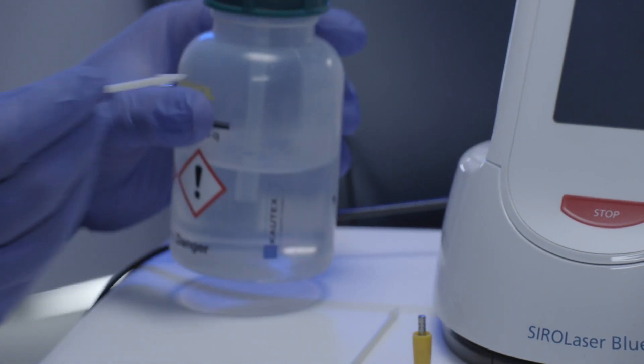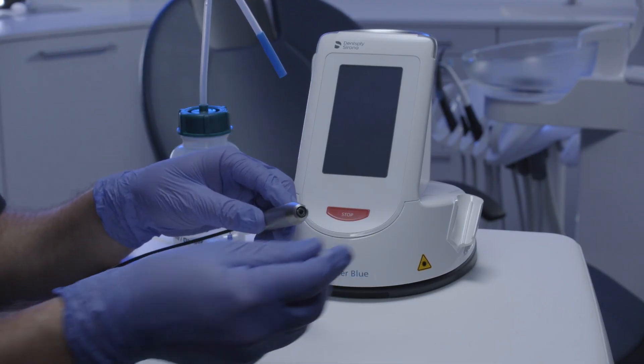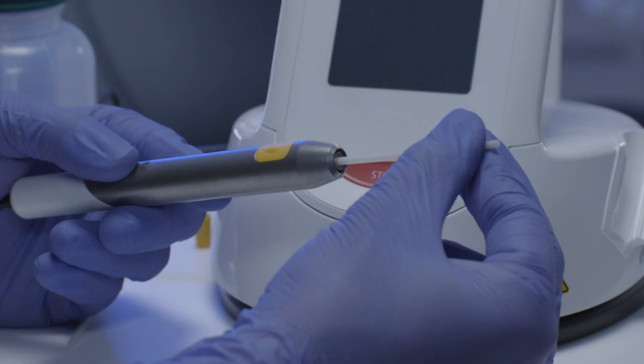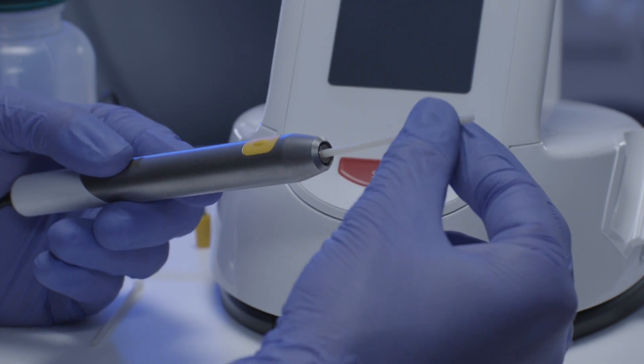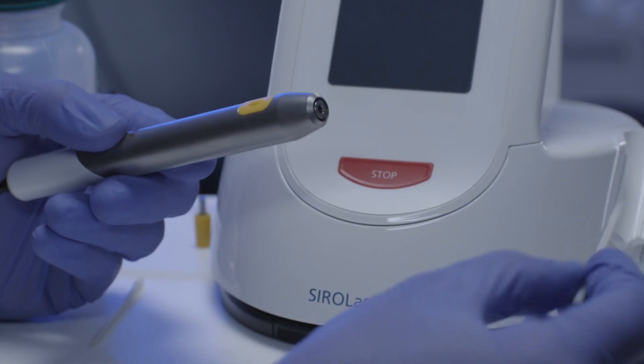Insert the lint-free cleaning swab into the handpiece optics and clean the optics by gently rotating the swab. Remove the lint-free cleaning swab from the handpiece optics after cleaning.